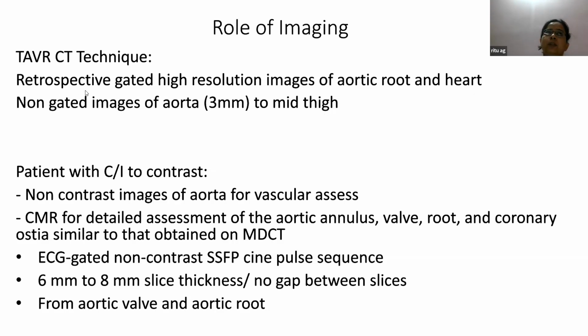Initially, we were using up to 80 to 100 ml of contrast, but now we have a newer machine, the Philips 256 scanner, and therefore we are trying to do it with a lesser amount of contrast. And we have been pretty successful so far.